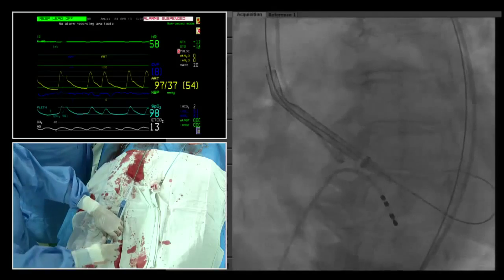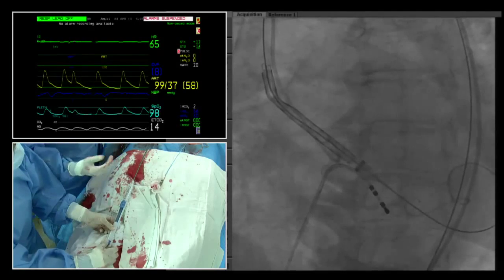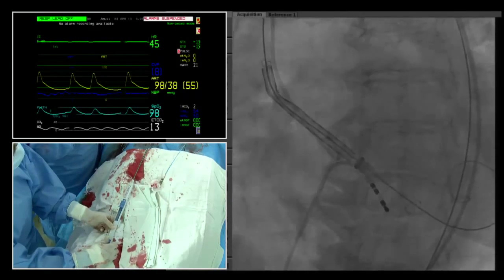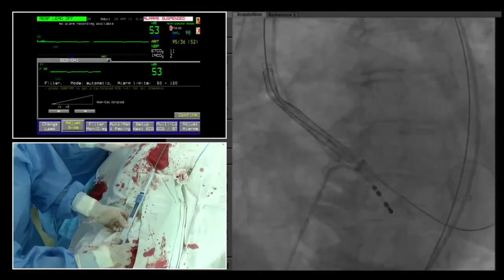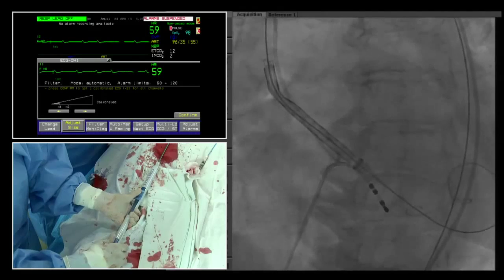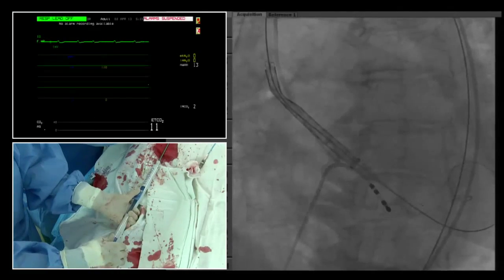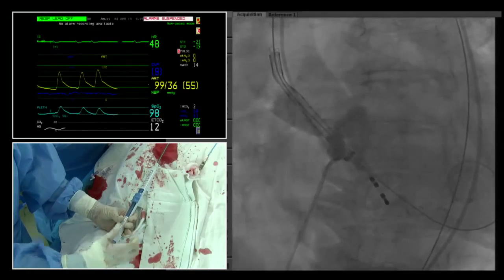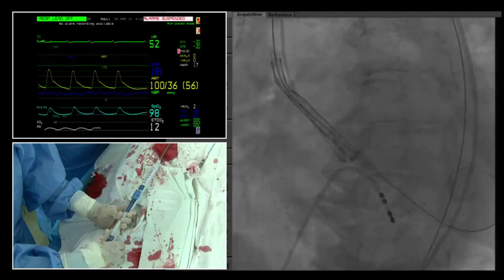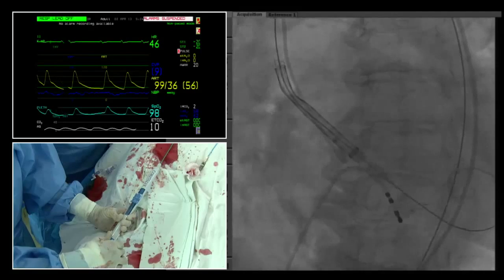Deployment begins with rotation of the device. The operator advises going a little quicker for the first centimeter due to catheter elasticity. The first operator (John Claude) secures the valve position without pulling, watching as Kim deploys. Knowing that the valve will move inward, it is being deployed from a relatively high starting position without concern at this early stage.